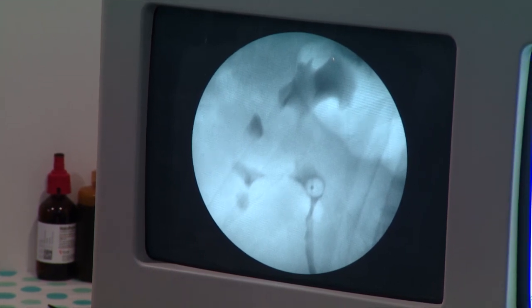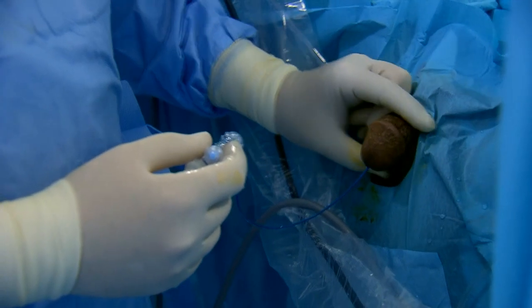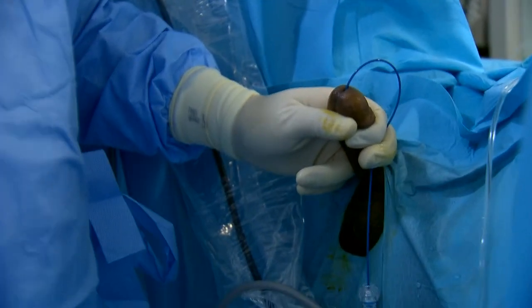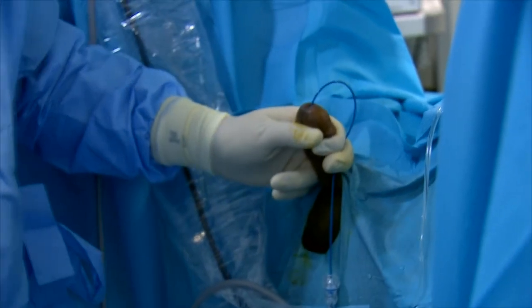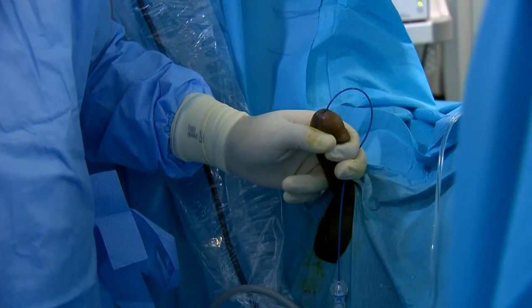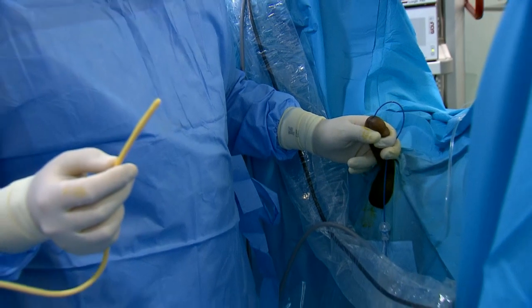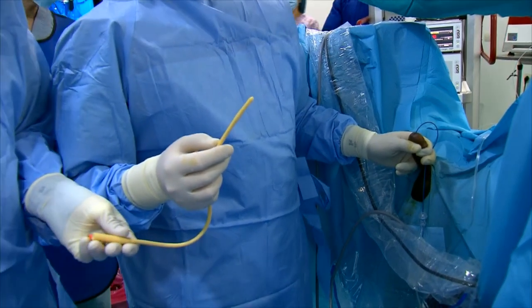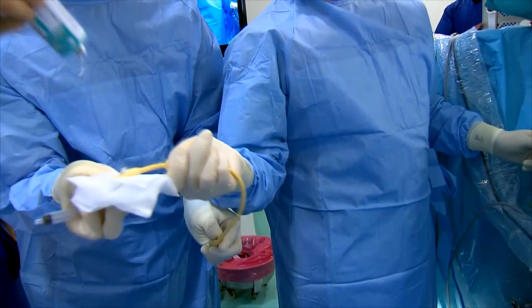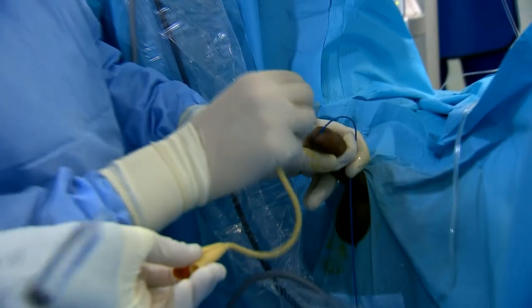Okay, now show this detail, please. We need a catheter, please. A usual catheter. We need a transurethral catheter. A Foley catheter, a small 16. I hold it like this. And now we need the catheter. Some gel, please. Always put the ureteral catheter to the top and insert the catheter in the bottom. It's like this.